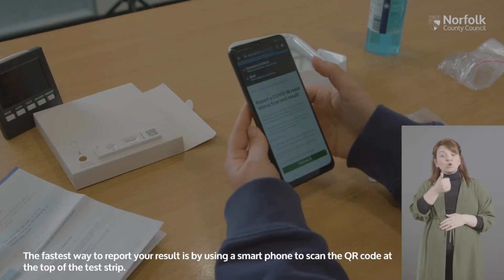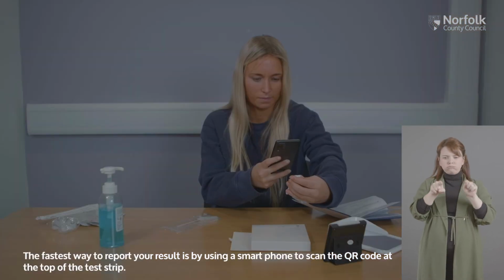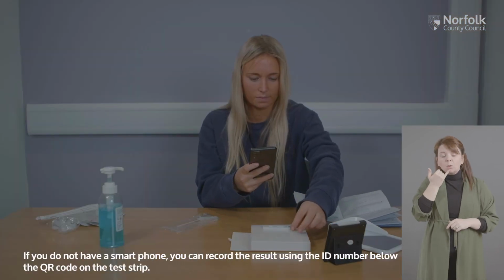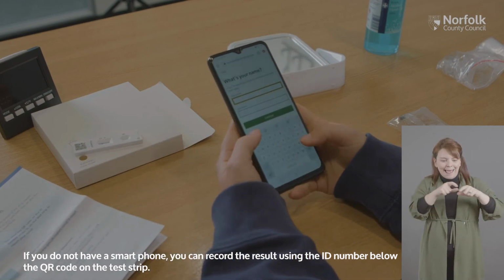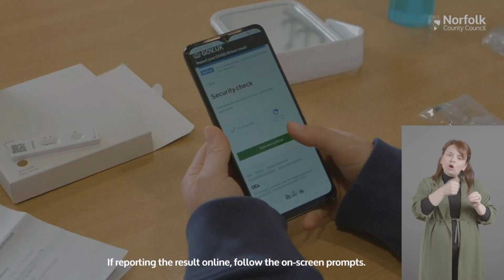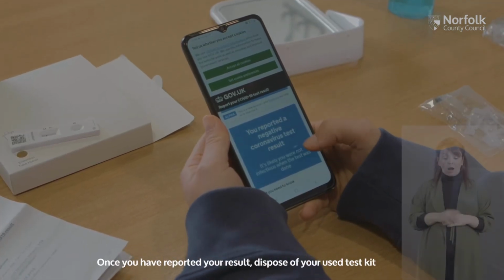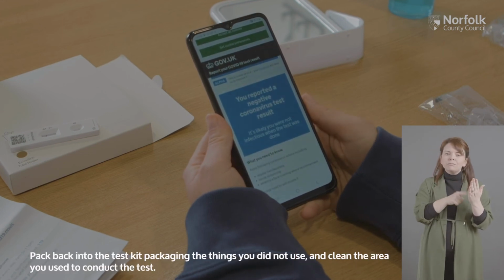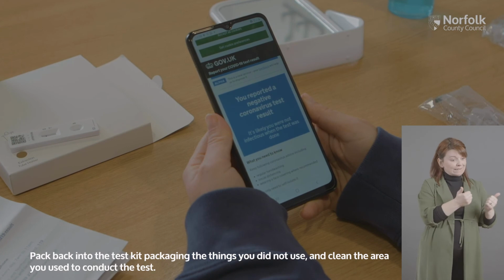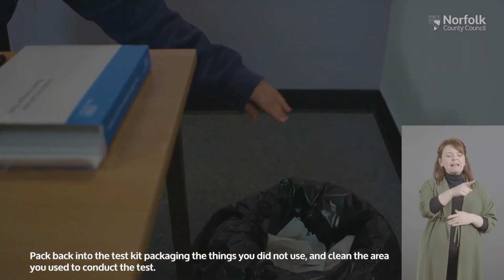The fastest way to report your result is by using a smartphone to scan the QR code at the top of the test strip. If you do not have a smartphone, you can record the result using the ID number below the QR code on the test strip. If reporting the result online, follow the on-screen prompts. Once you have reported your result, dispose of your used test kit. Pack back into the test kit packaging the things you did not use, and clean the area you used to conduct the test.